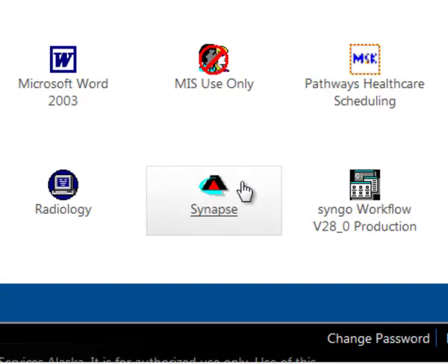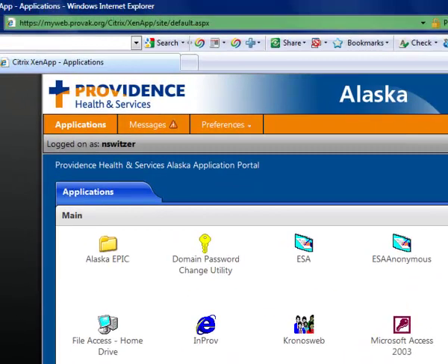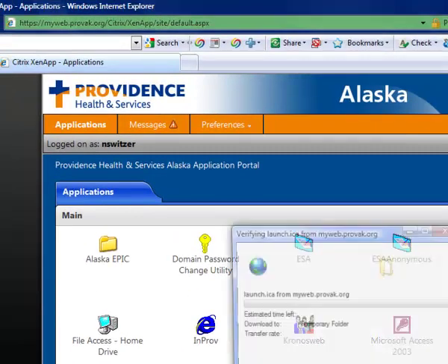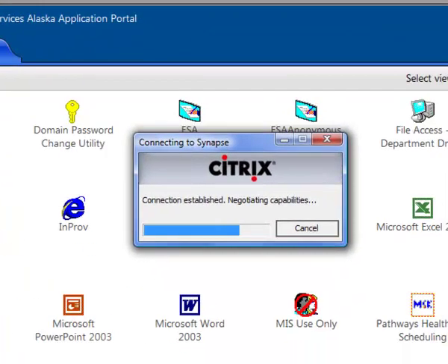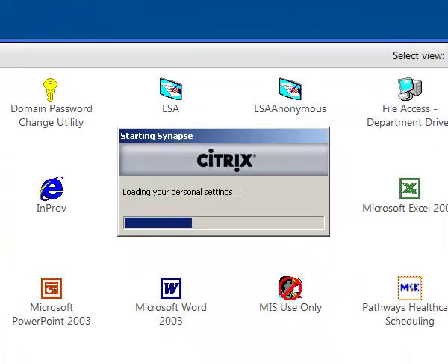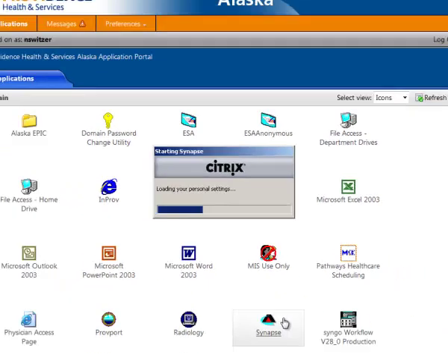Now click the Synapse icon once to launch the software. In a few seconds, depending on your internet connection speed, you will see this opening Synapse screen with several folder choices listed on the left side.